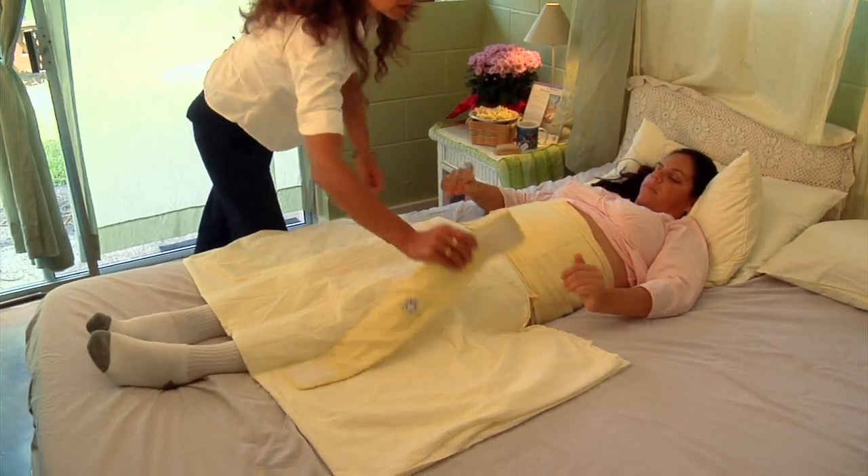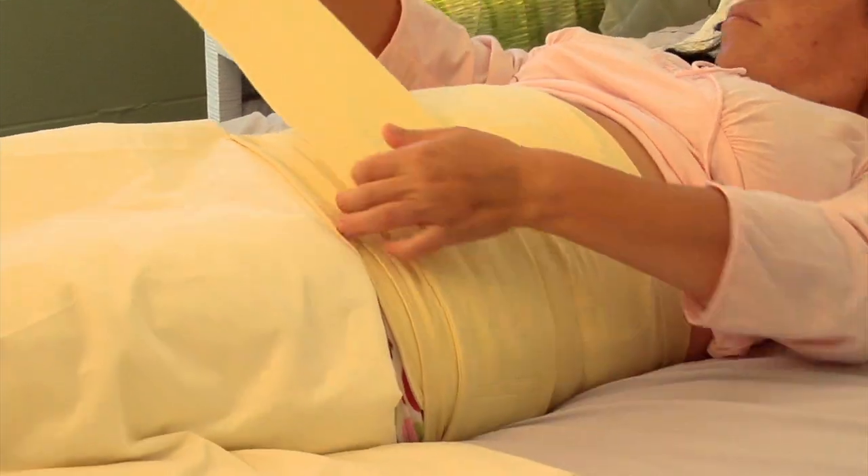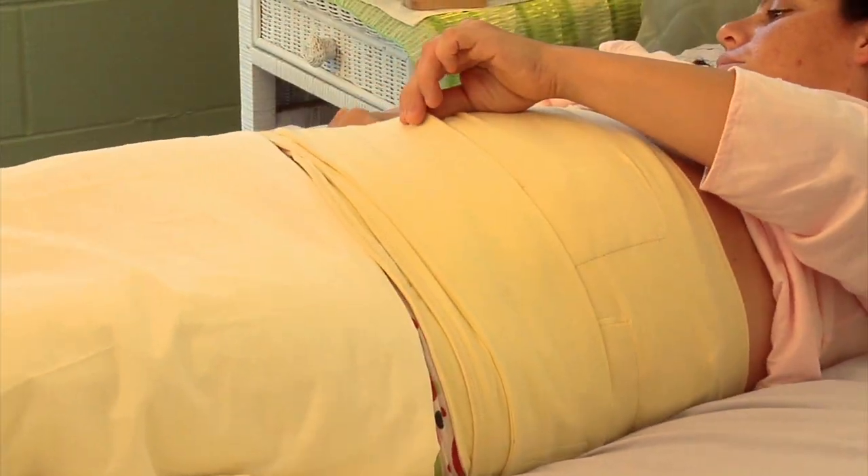If you should need some extra support, please attach the extra strap from hip to hip, across the front, or across your back.